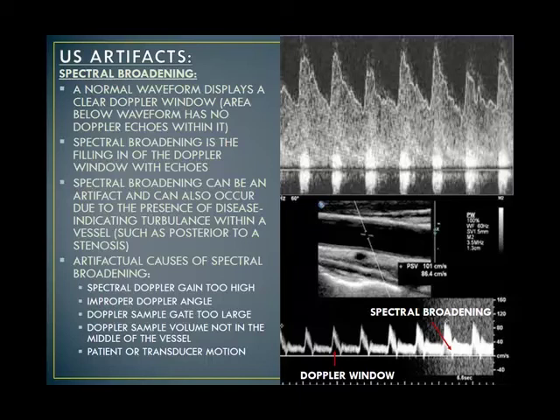We don't really get too much into this in the breast because we're not looking for turbulence, but you should know that sometimes your machine settings make things look like this. Your Doppler gain is too high and that type of stuff. So we'll learn a little bit about optimization.